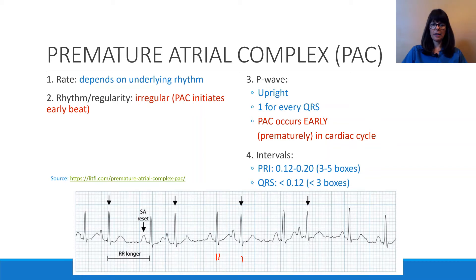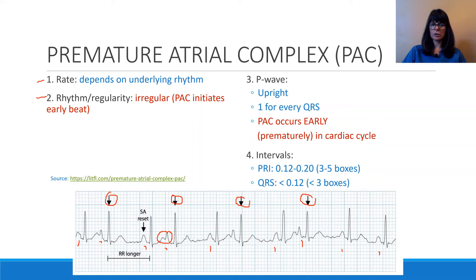The arrows on this rhythm strip signify the early beats, or the PACs. Every other beat on this rhythm strip has a premature atrial contraction, confirming the irregular rhythm. The P waves are upright throughout — upright, upright, upright. One of them is almost merged into the T wave from the previous complex. All P waves march out, with one for every QRS.